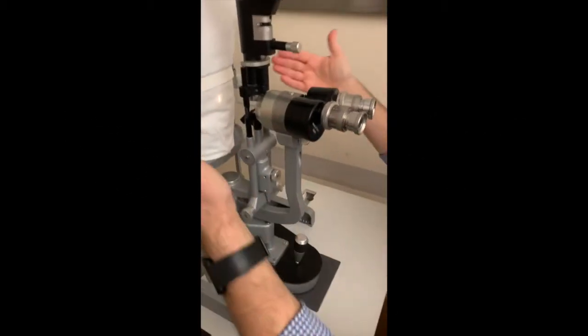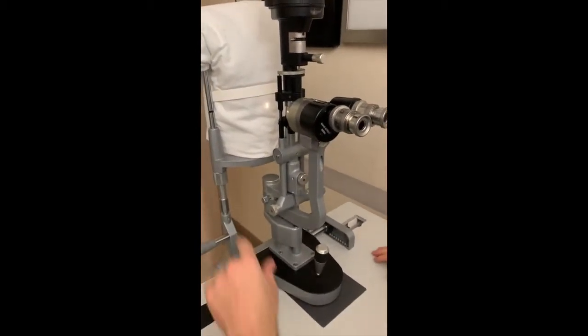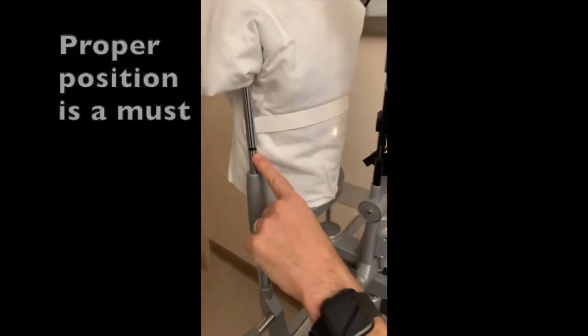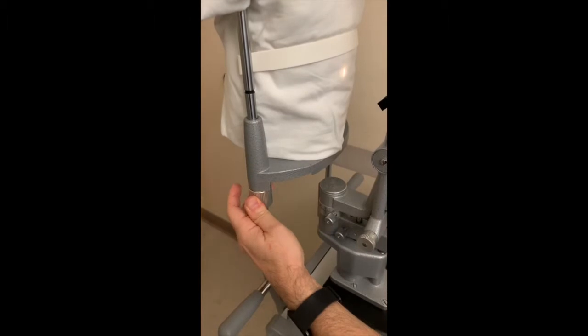The next thing is you have the patient sit. And you want the patient's eye level to be at the level of the black dot. So that's where their eyes need to be when they're sitting. And you get their eyes there by adjusting the chin rest up or down using this.